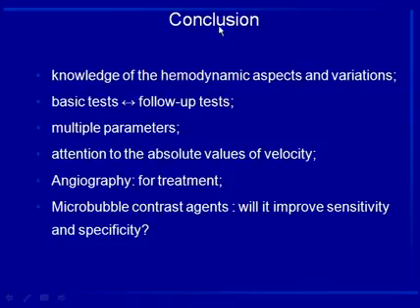In conclusion, it's important to know the hemodynamic aspects and variations based on basic tests and follow-up tests, using multiple parameters for TIPS evaluation and paying attention to the absolute values of velocity. Angiography is reserved for treatment, and microbubble contrast agents improve sensitivity and specificity in some cases.